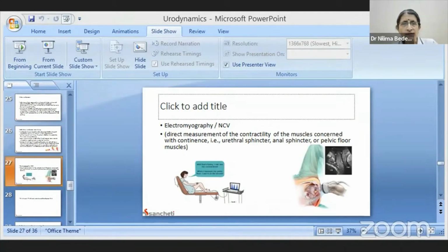So when we say it is stress incontinence after testing with cystometry, it is also called genuine stress incontinence. A term is given like this when the bladder is stable during the storage phase. So it doesn't get provoked. On provocation also, it does not increase the pressure inside the bladder. So on the cystometry, if the bladder is stable, we know for sure that it is not overactivity, and the treatment can then be jotted down accordingly.